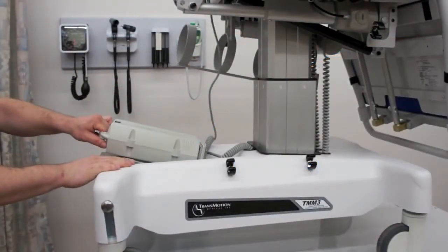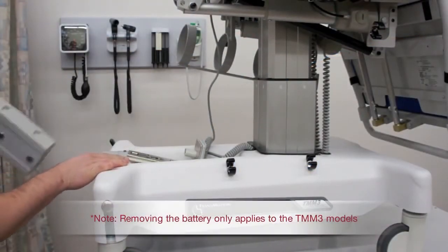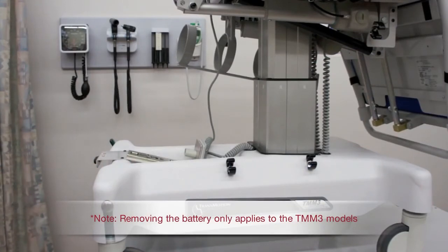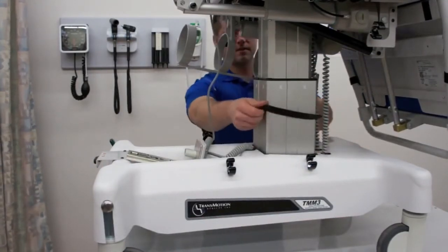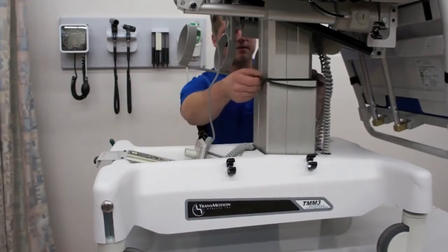Remove the battery from the top of the base cover. This only applies to the TMM3 series stretcher chair. Lift the rubber cover slip up on the column for access to the base cover.